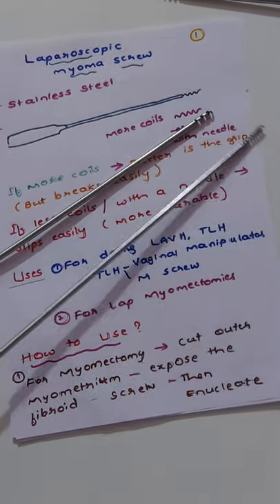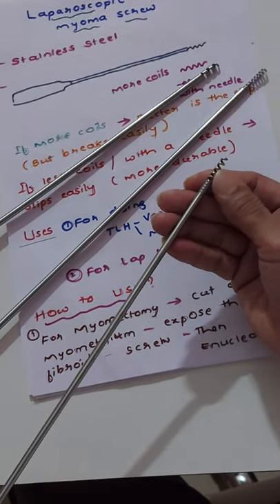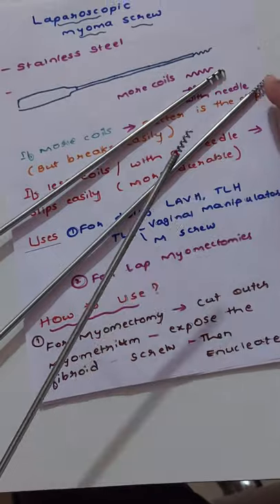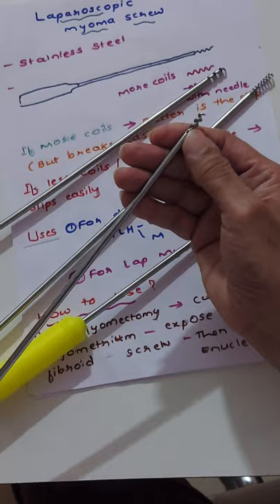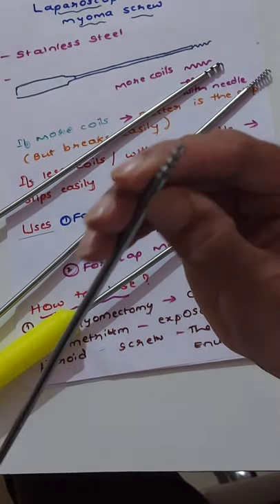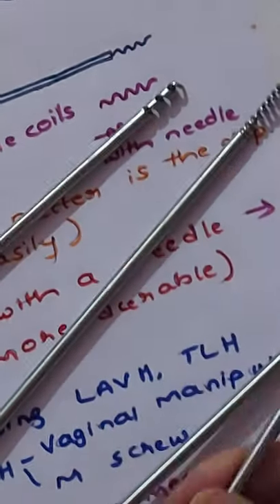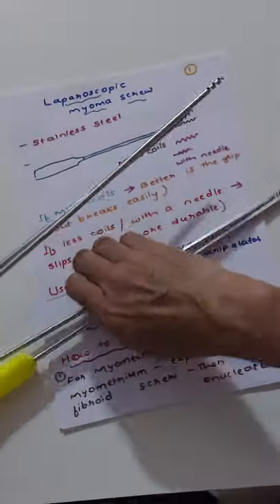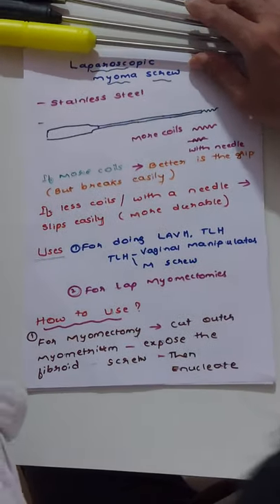The coils can be minimal. Here the coils are about five turns, here six to seven turns, and here you can see only three turns. But inside there is a needle — you can see a needle inside. So these are the varieties of myoma screws.